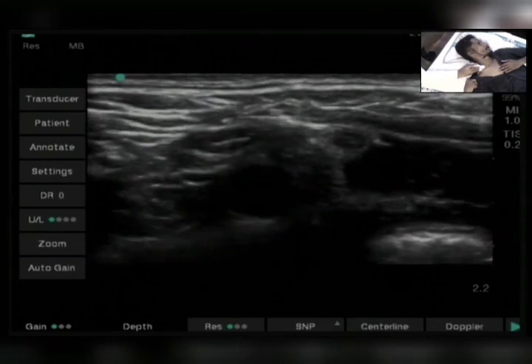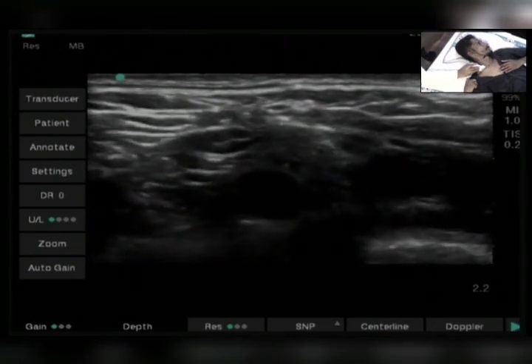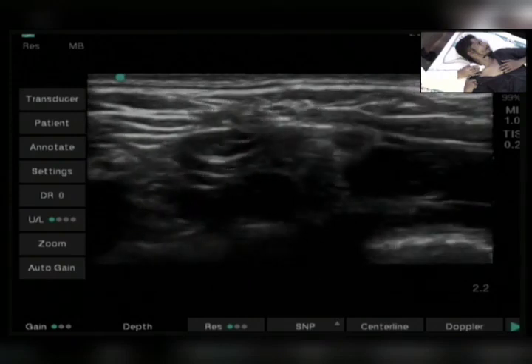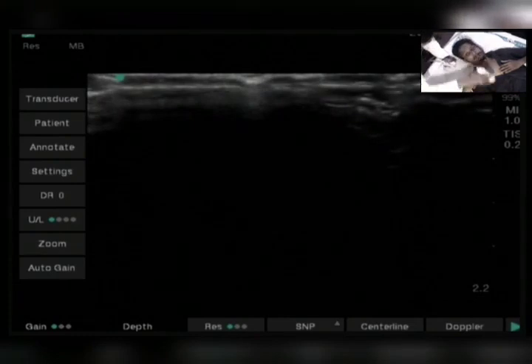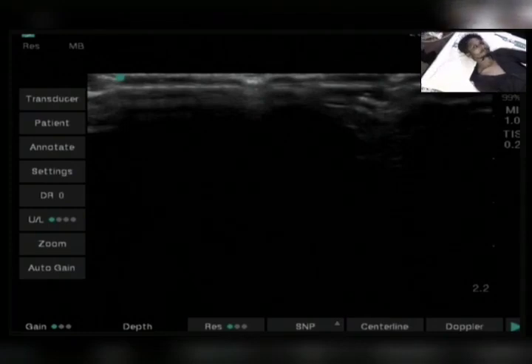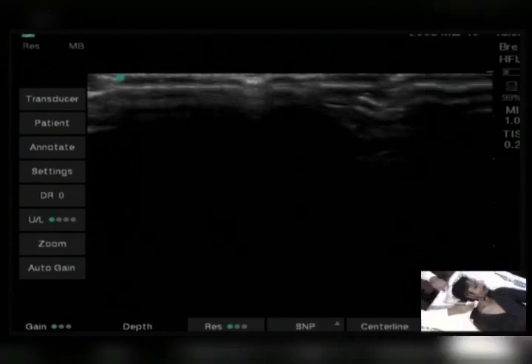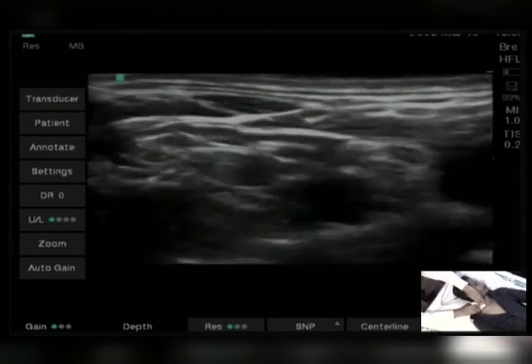Most of the time before the block I use scanning, and then I go for block and needling. Okay, so here we need the patient leg up please, and head up. Okay, relax. Sonography check.